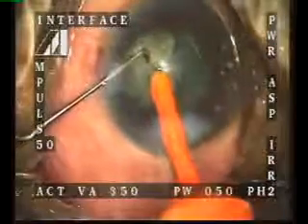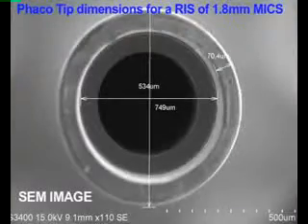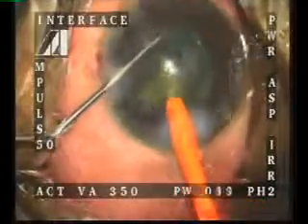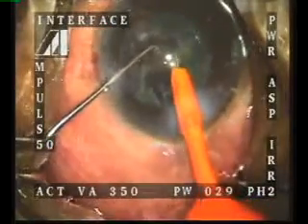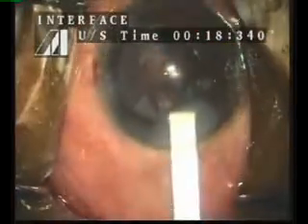1.8 mm and 2.2 mm phacosurgical procedures produce excellent chamber stability due to minimal aspiration fluid turnover. This provides an effective workspace by creating a deep anterior chamber. Post-phacoemulsification, this altered size is the passive incision size. This stretch factor varies according to the phacosurgeon's maneuverability and also the patient's corneal tissue condition.